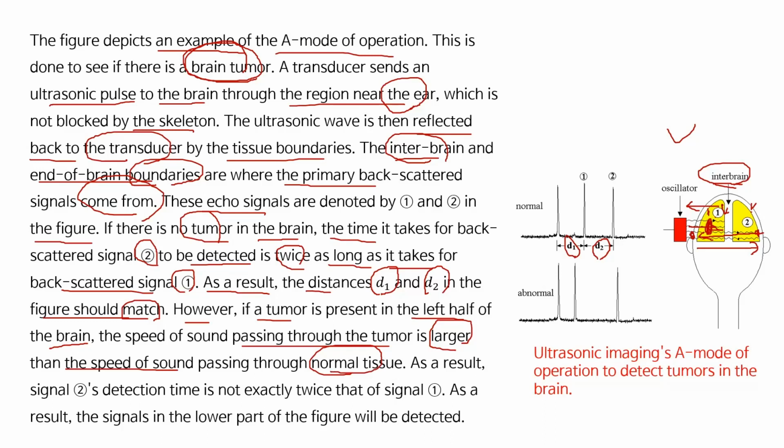So as a result, signal 2's detection time is not exactly twice that of signal 1.